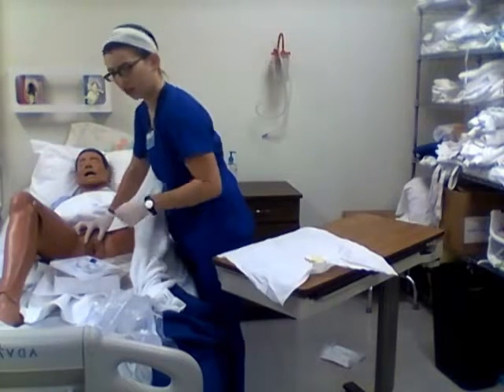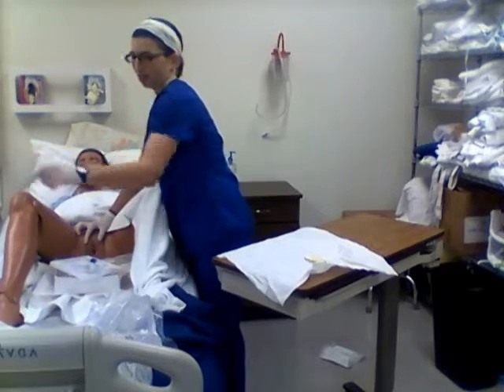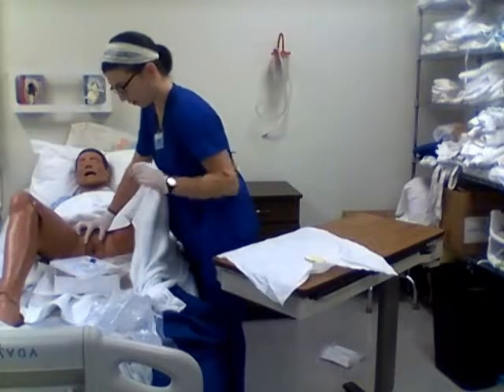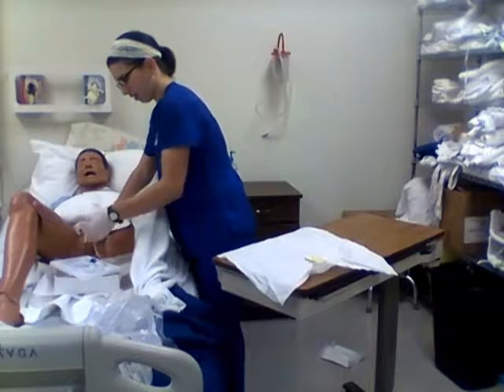Outer edge, throw it away. Same thing but towards me. Outer edge, throw it away. And then once down the middle. There we go. Throw it away. And so now we can take the catheter out of the lubricant. We now have that sterile.